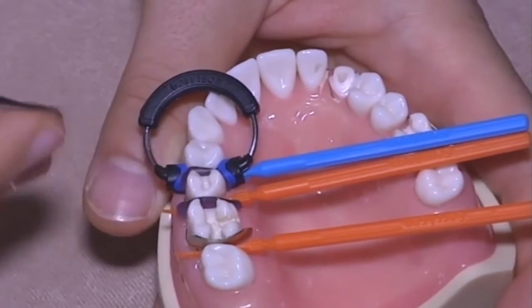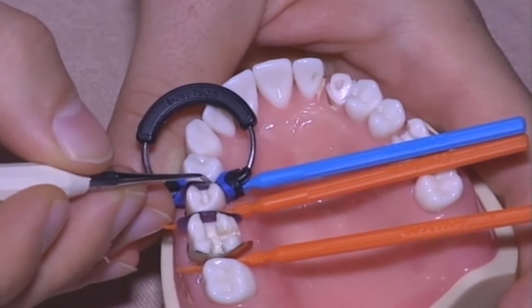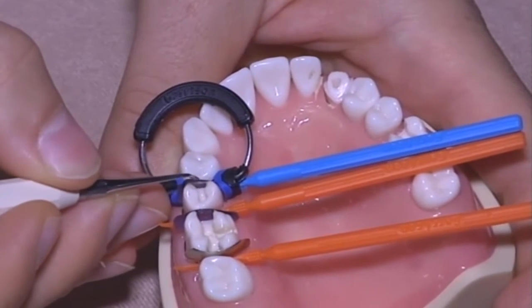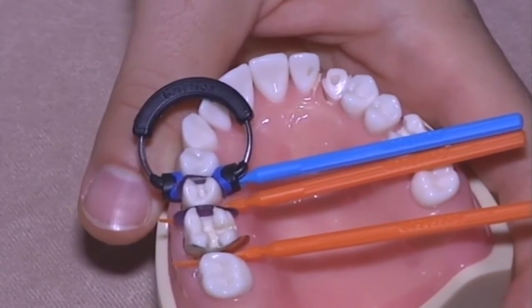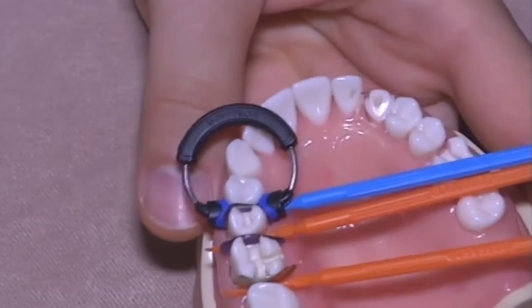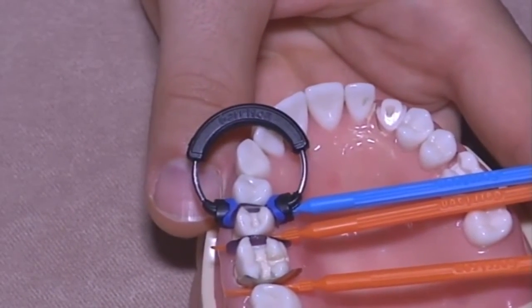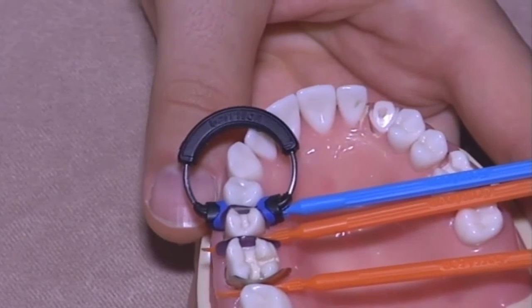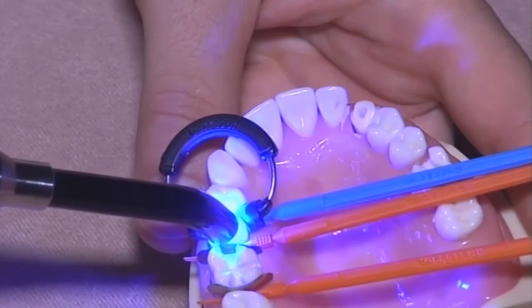And any matrix can simulate that perfectly. You have to do that with a thin spatula. And if you regulate the right amount of composite, you will obtain a very, very thin interproximal wall. Light curing.